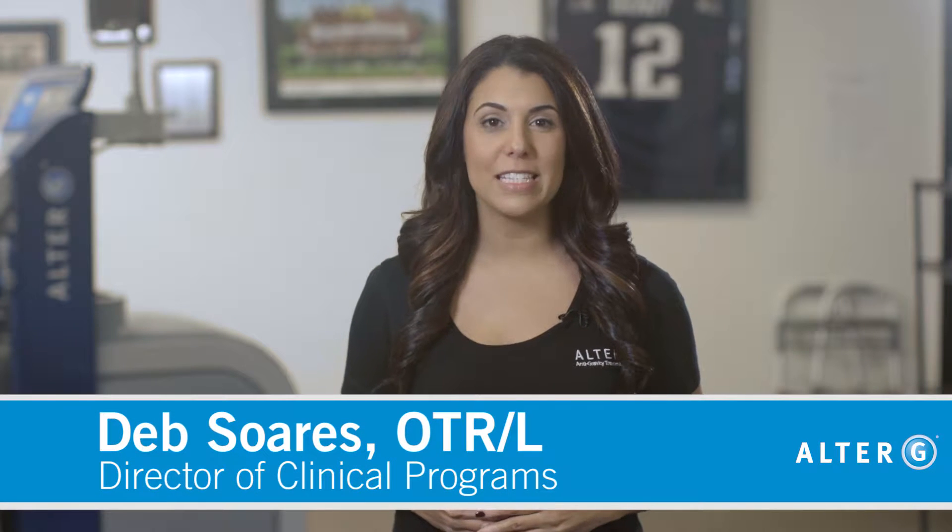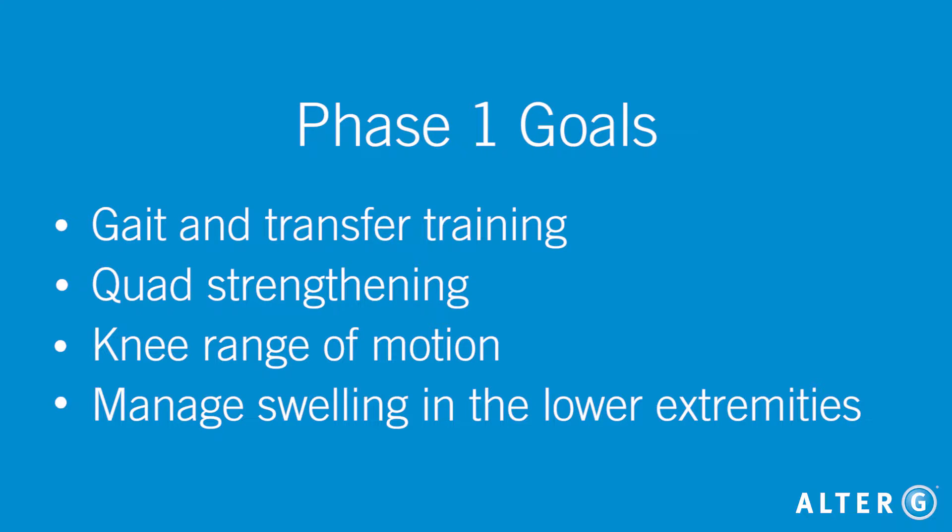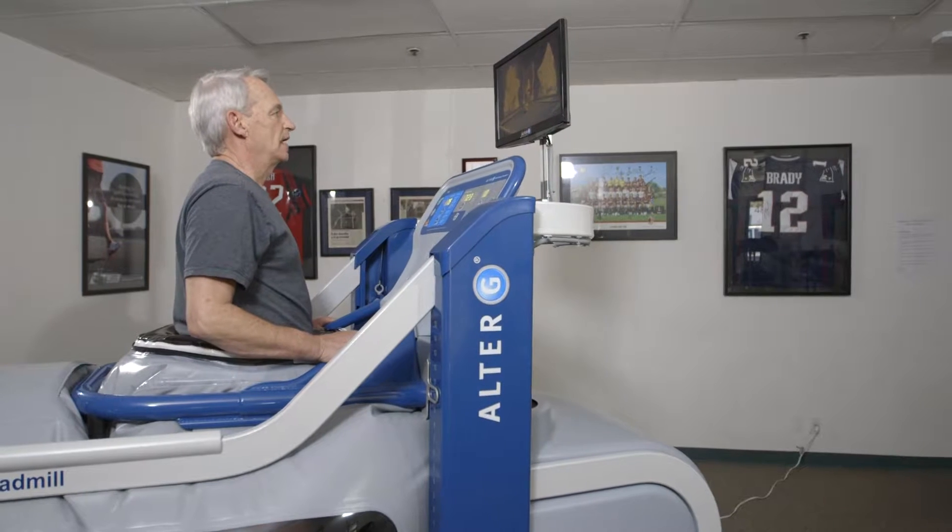The focus during this acute phase includes gait and transfer training, therapeutic exercises for quad strengthening, knee range of motion, and managing swelling in the lower extremity. The AlterG treadmill can be used to help a patient regain normal gait mechanics in a fall-safe environment during these initial days.